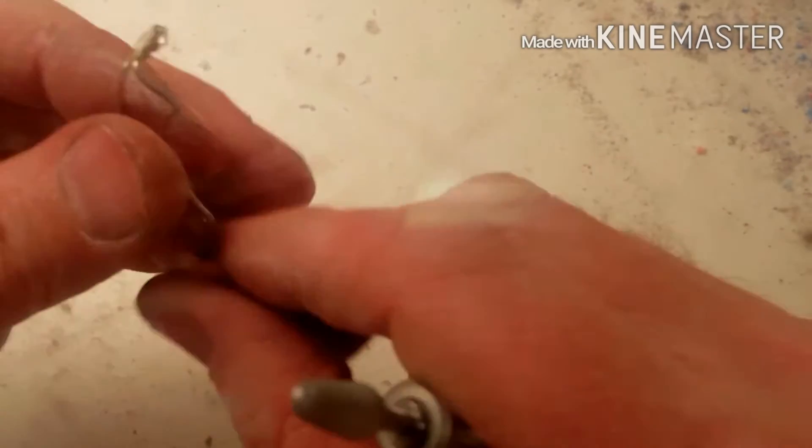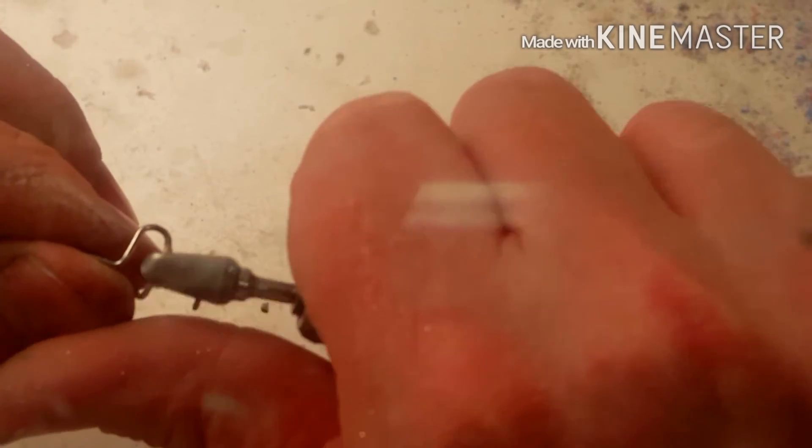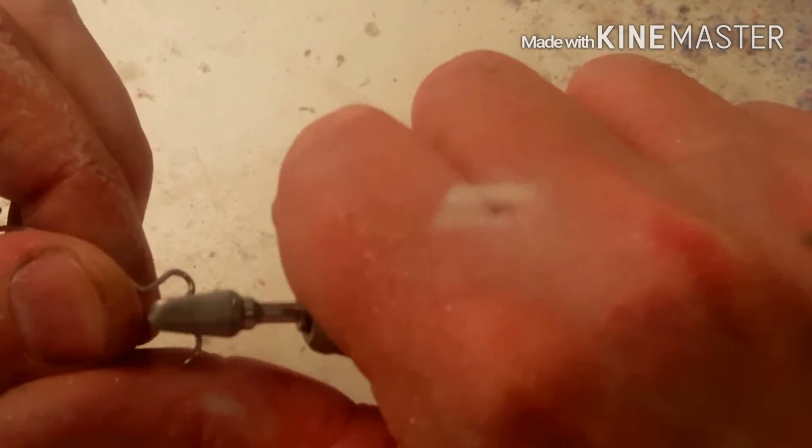I'll then switch up the burr and use more of a tapering burr just to do some tighter finishing. We'll see that in a second.